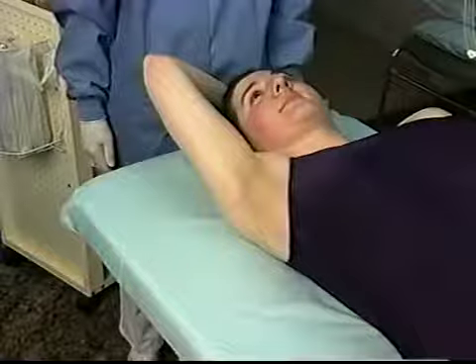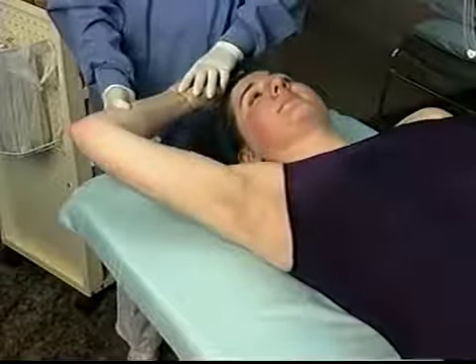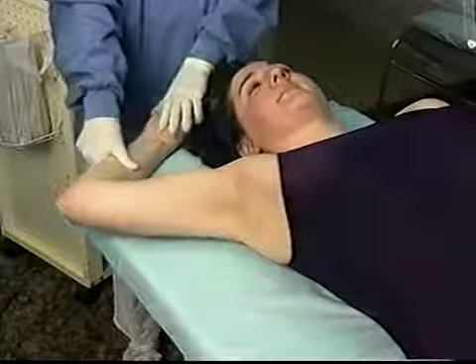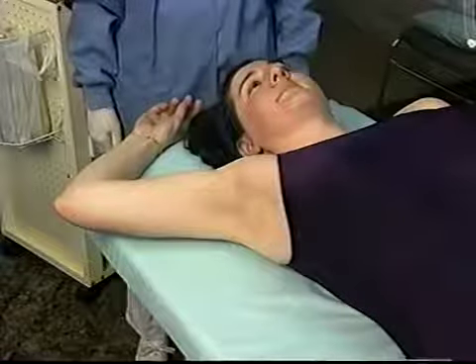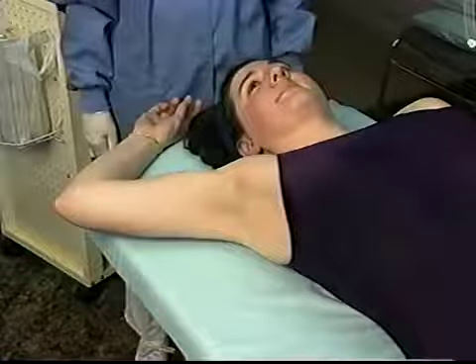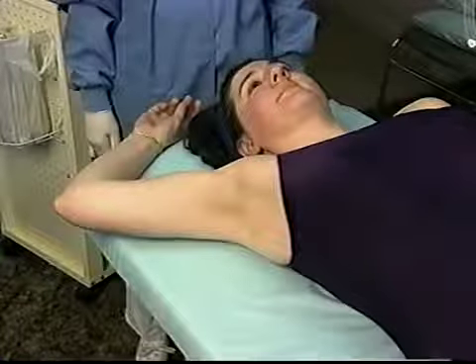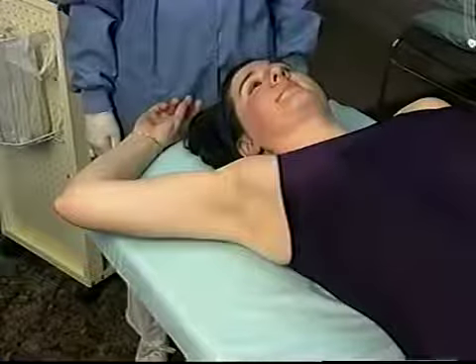For the axilla, position the patient on her back with or without a head pillow. I let her decide. Bring the forearm up alongside her head. Patients generally have a tendency to bring the forearm close to their head. I find it is better to position it further away from the head because this stretches the skin and gives a flatter area to work on.